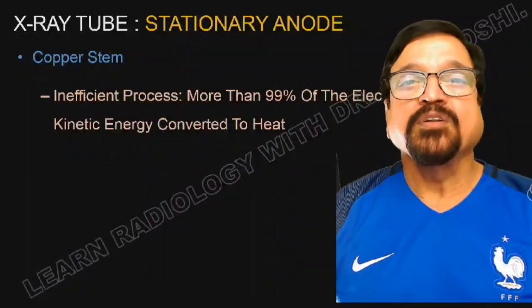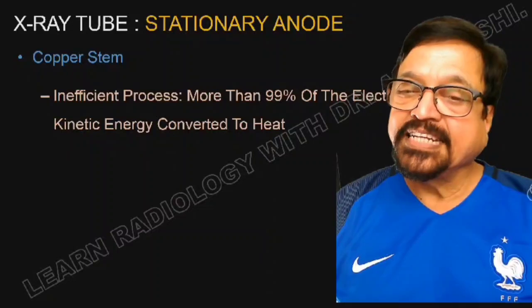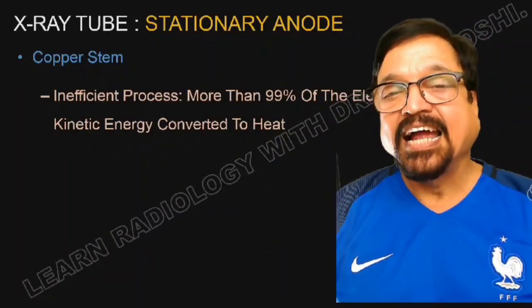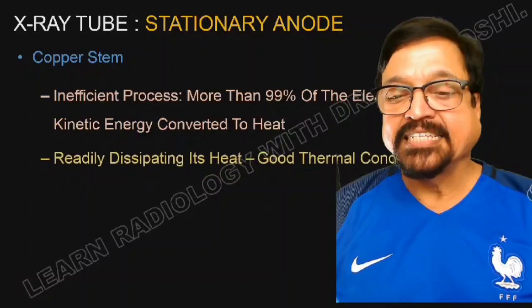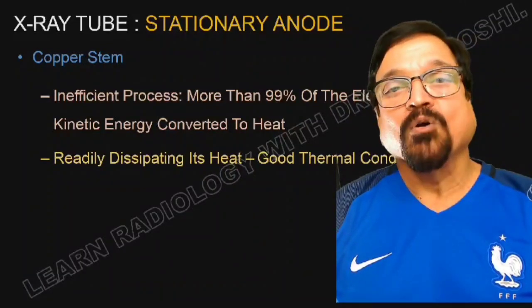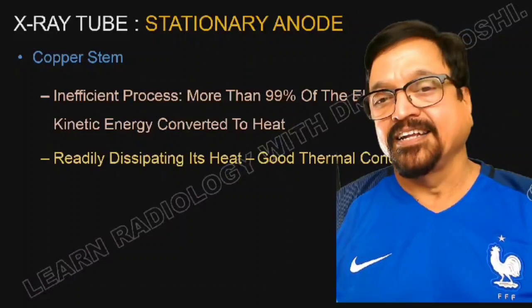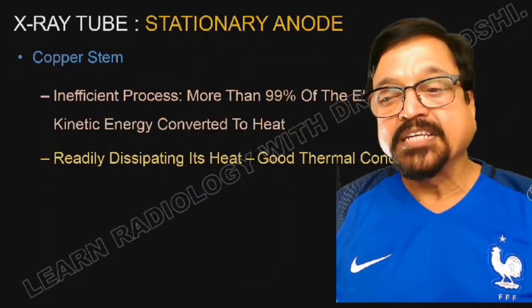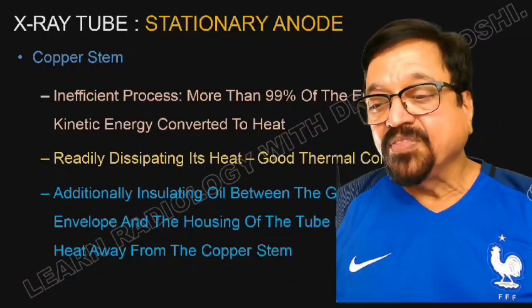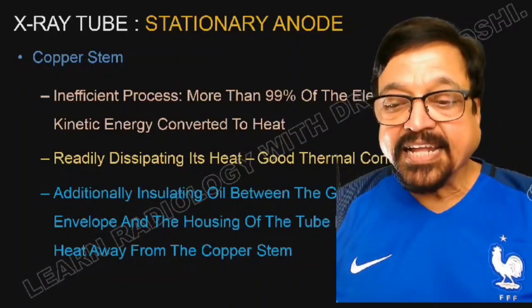Because 99% of the electrons, when they get converted into photons, that is X-rays, 99% of the production is heat and hardly 1% is X-rays. Now this heat needs to be dissipated. Copper is an excellent conductor. That's why it is used to dissipate the heat in a fast way.